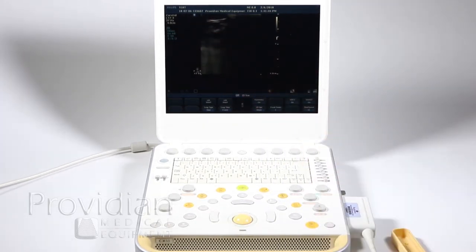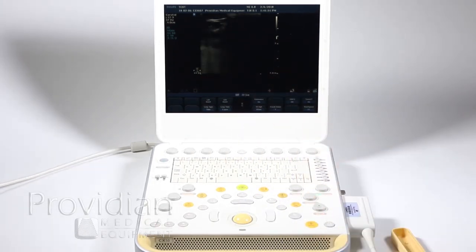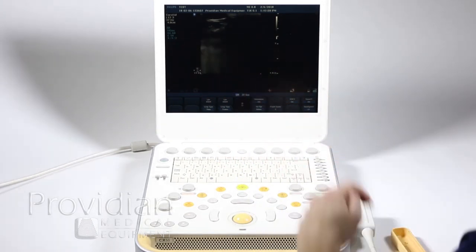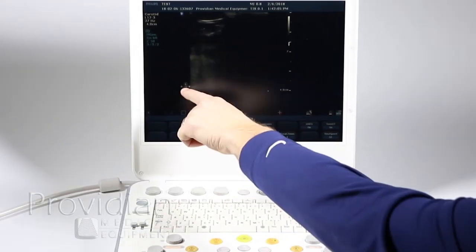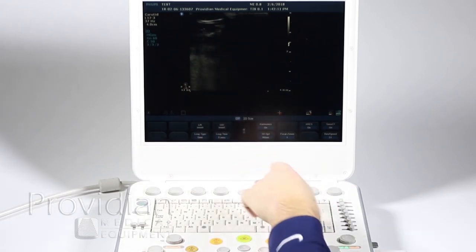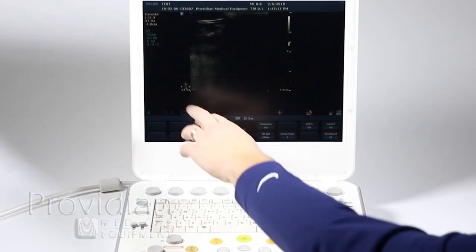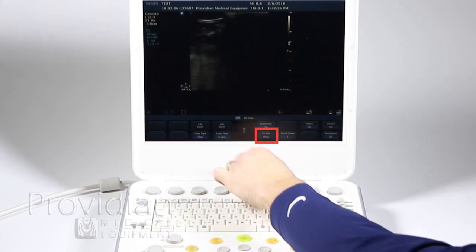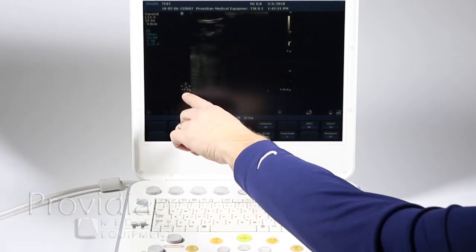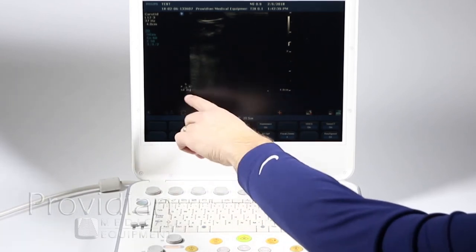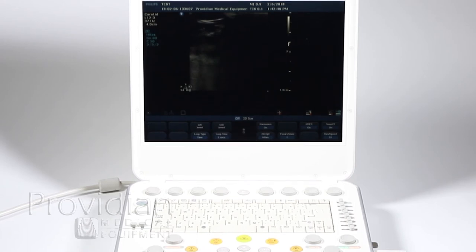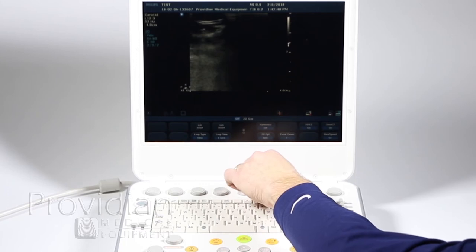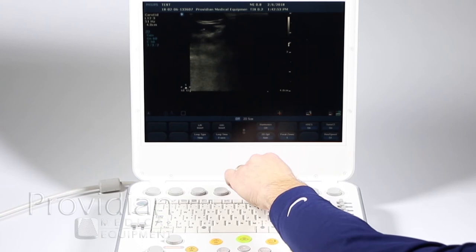Up here it tells you what you're looking at: carotid, the probe is the L12-3, 37 hertz is your frame rate, and the depth is four centimeters as shown by the depth markers. You have H-gen — that is your harmonics imaging at the general setting. That refers to the triangle with P, G, and R: P is penetration, G is general, and R is resolution. The numbers show the frequency ranges — for penetration it uses a lower set of frequencies, 4 to 8 MHz; for G it's 4.4 to 8 MHz; and for H-res it's 5 to 10 MHz, showing the range of frequencies used with tissue harmonics. If you turn harmonics off, it gives you specific frequencies for penetration, general, and resolution.